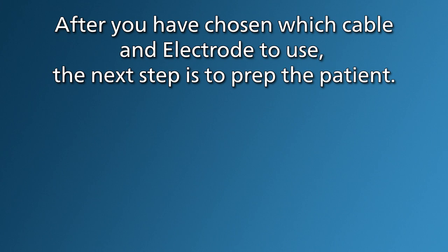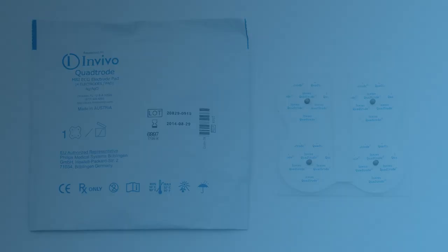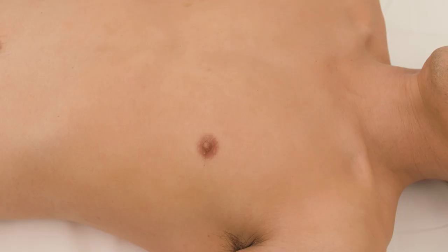After you have chosen which cable and electrode to use, the next step is to prep the patient. Proper electrode preparation is critical to ECG performance. The result of poor electrode preparation will be poor ECG monitoring performance. Be sure to check the date on the electrode to ensure that it is not expired. Next, it is important to shave or trim any patients with excessive hair. Large amounts of hair will inhibit a good conduction between the electrodes and the patient's skin. Also, if the hair creates an arc behind the electrode, it can be a burn hazard.